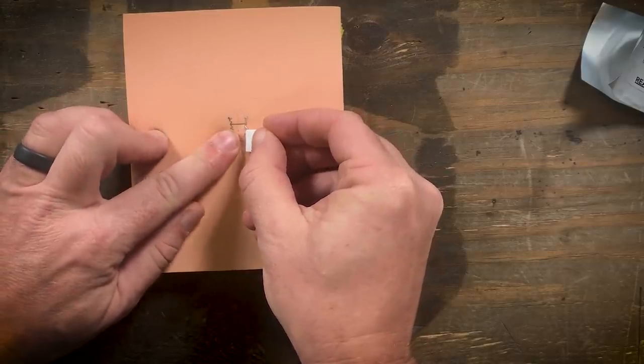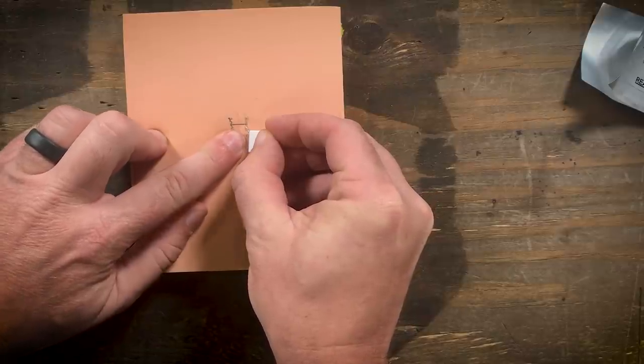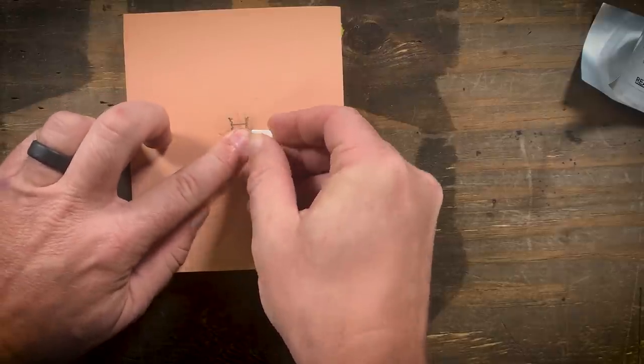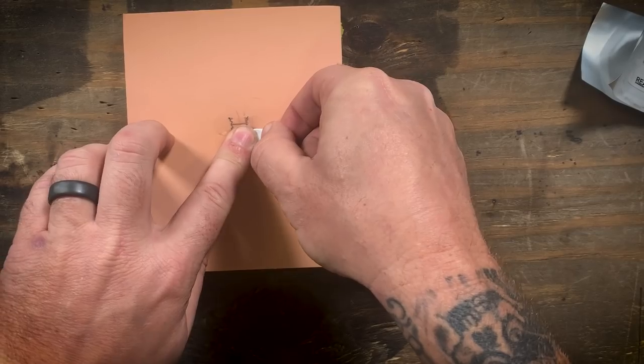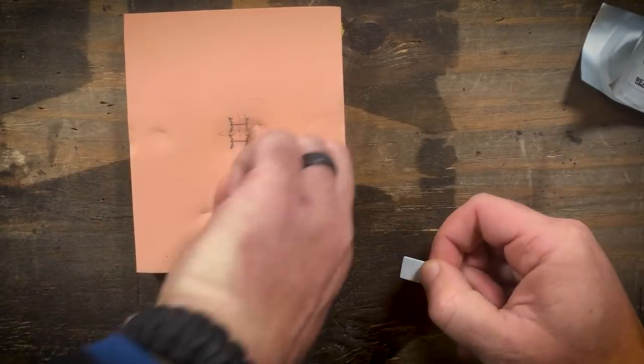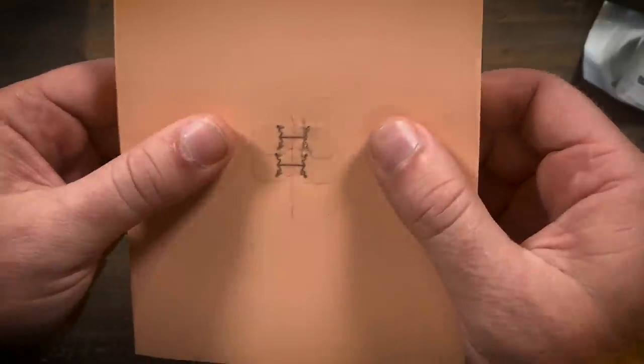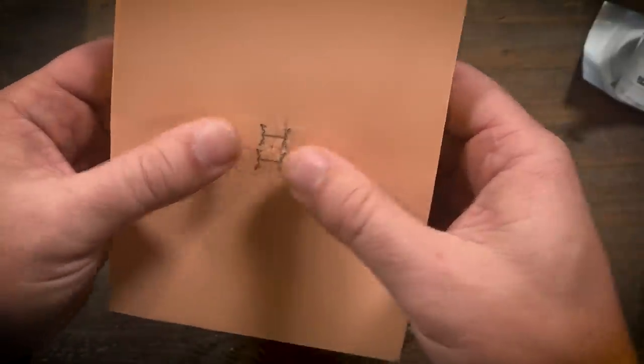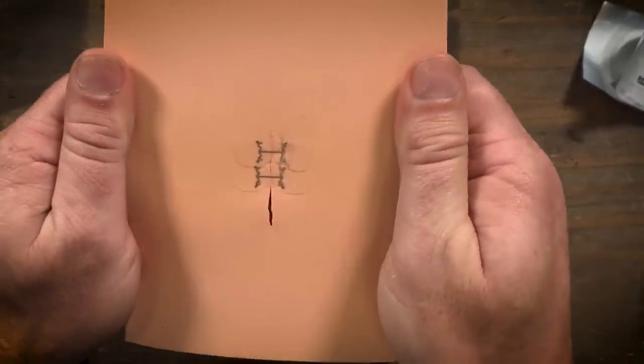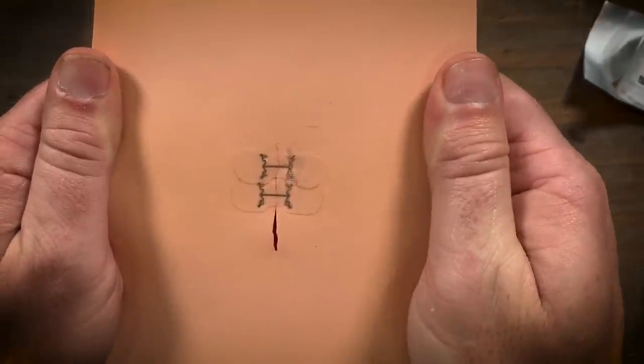Press toward the wound. Stretch it a little bit. Press for the tab. There we go. A very strong solid closure right there.